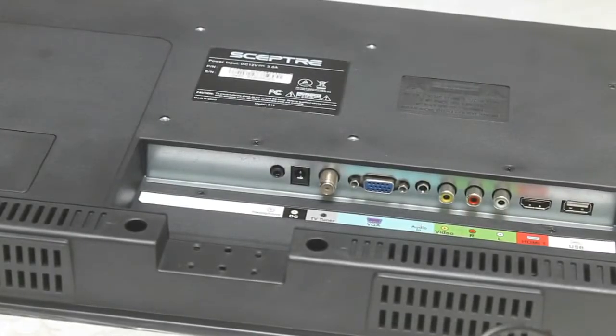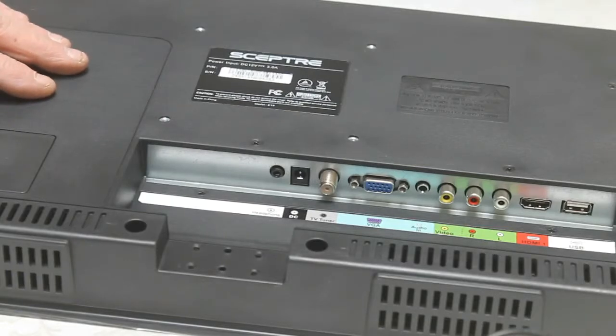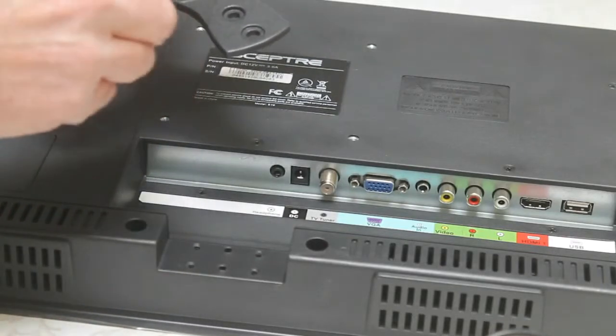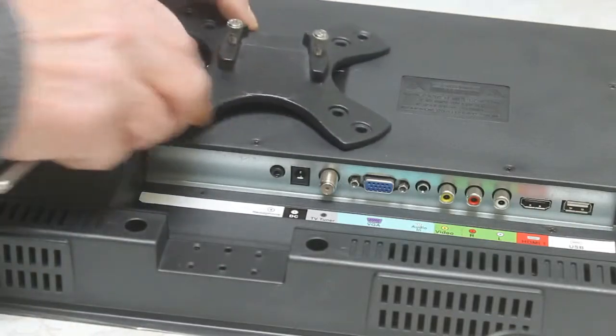This instructional video will teach you how to set up the DAS Acuity system. The first thing you do is remove the monitor from the box and lay it down on a clean surface. The next thing you do is install the wall mount. You'll see the wall mount has a larger opening here than it does on top. The larger opening goes towards the bottom of the monitor.